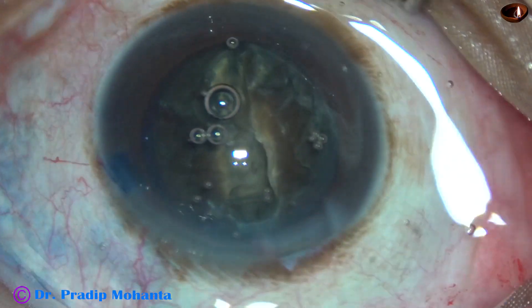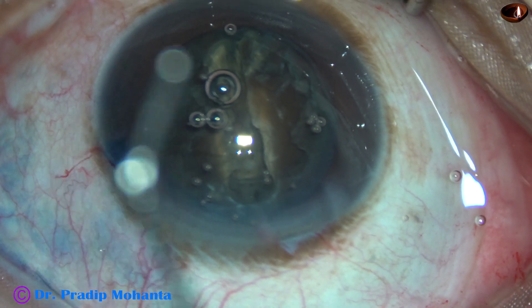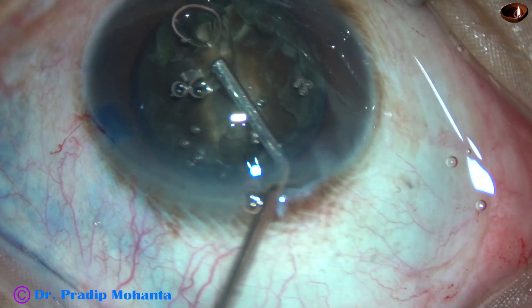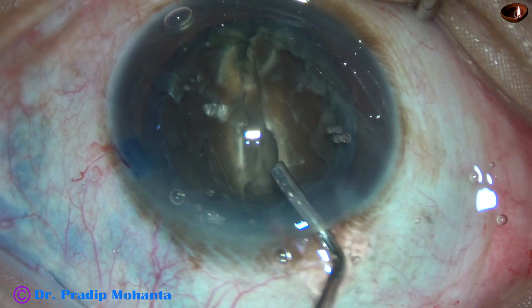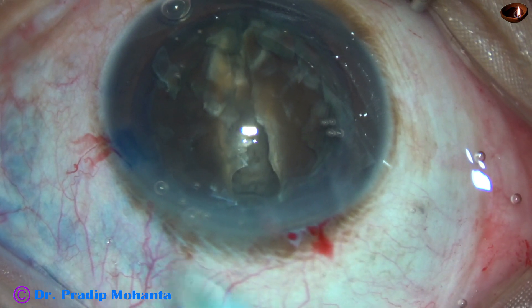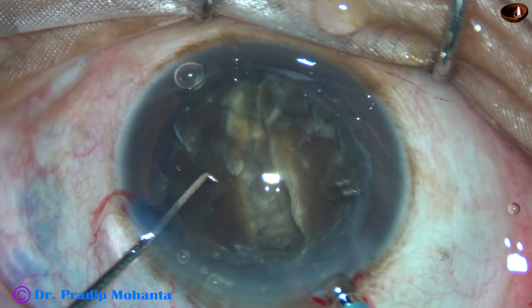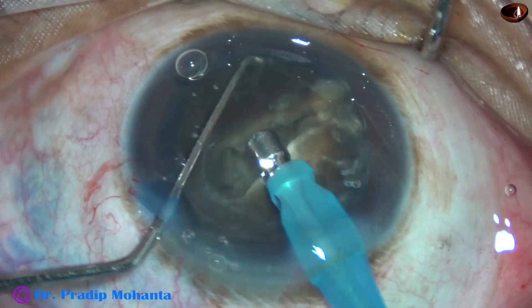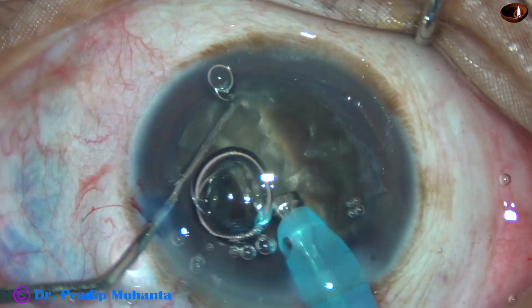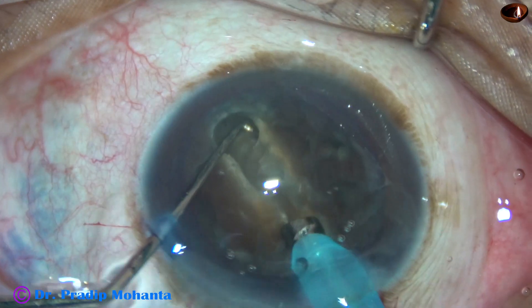This air bubble is disturbing. I am going to remove this air bubble by injecting some visco in the anterior chamber, but the air bubble went towards 6 o'clock. I decide to go in, rotate the nucleus 180 degrees, and then use vacuum to remove all the air bubbles.